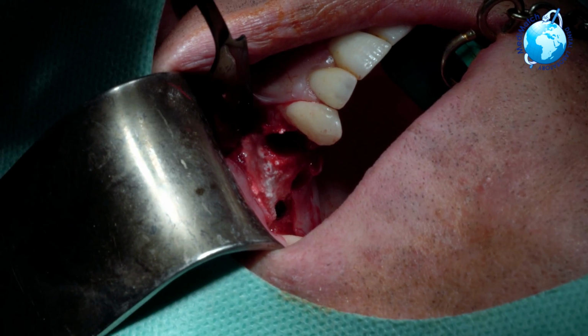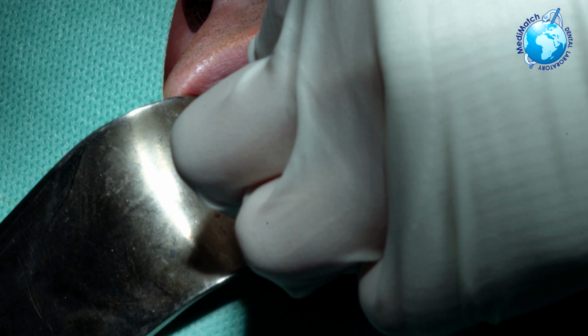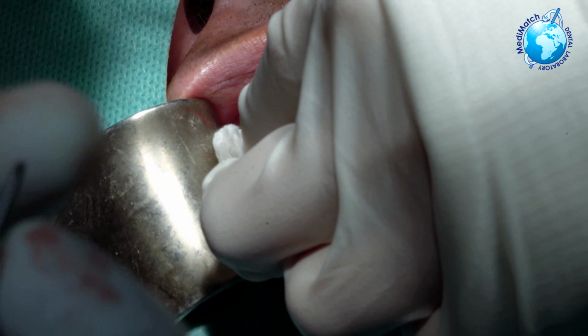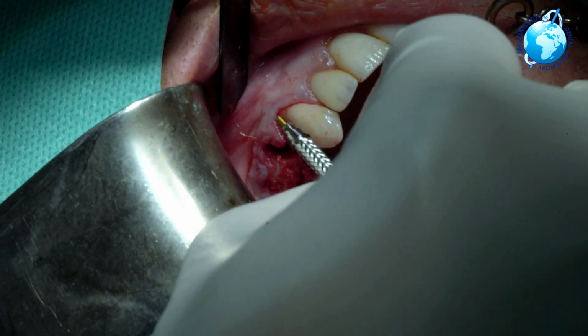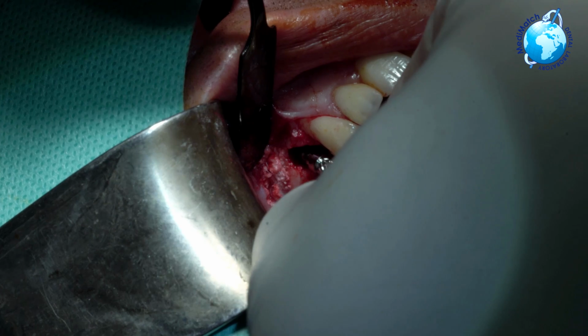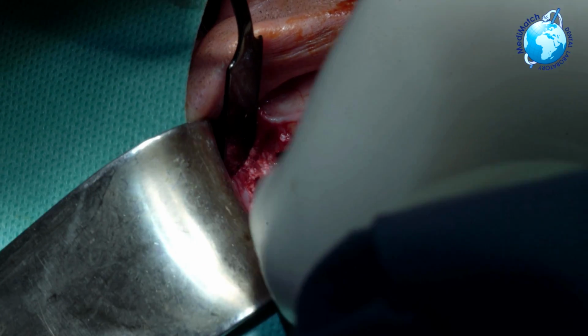Give me the temporary abutment. The titanium temporary abutment, yep. And do that. So a couple of temps on, and we can directly scan flag this using the Trios system to make our bridge in a month. Okay, Alan, you good? Awesome. Open wide, sir. Move your right hand down a bit, Avik. That's it. Just trying to block that in.